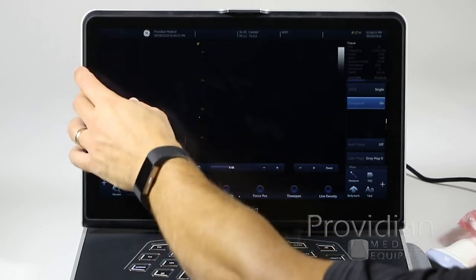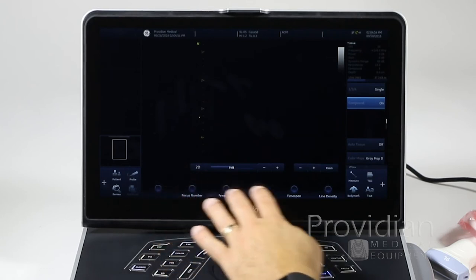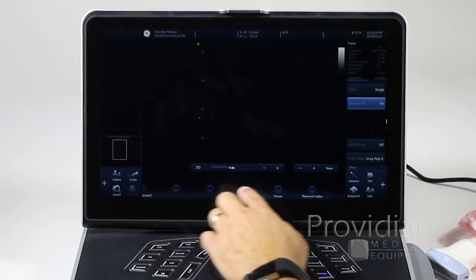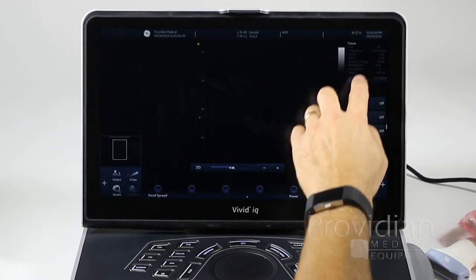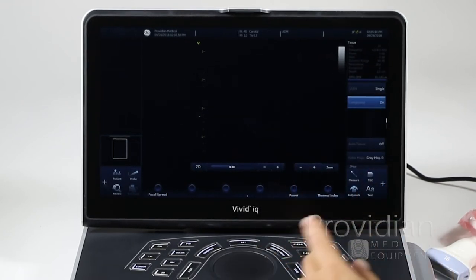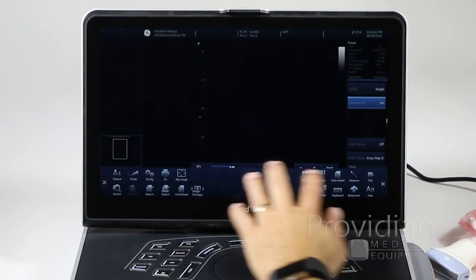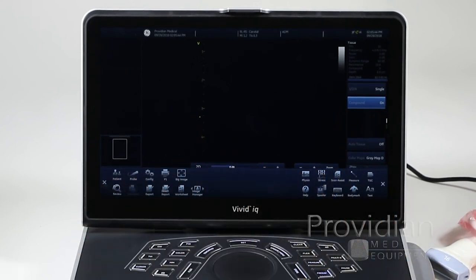Over here you'll have some saved images, plus all your image optimization options across a few pages. And there's another set of menus down here — just click the plus icon and you have a whole series of things you can change.